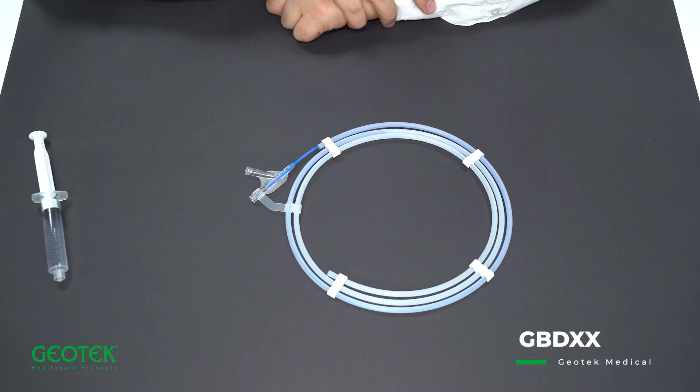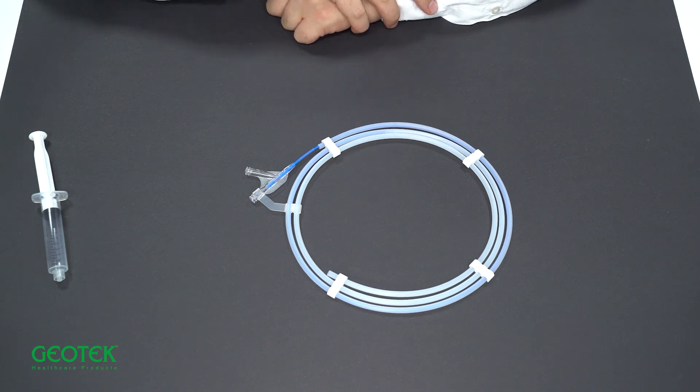Ureteral balloon catheters are extremely useful instruments both for widening and passing ureteral strictures and for allowing retrograde opaque films to be taken in the same session.